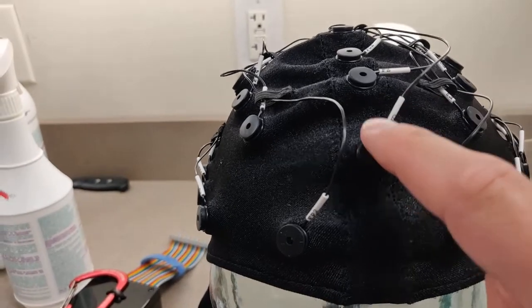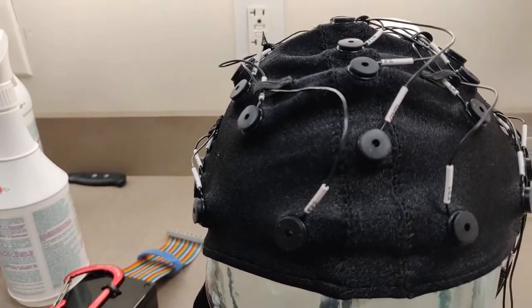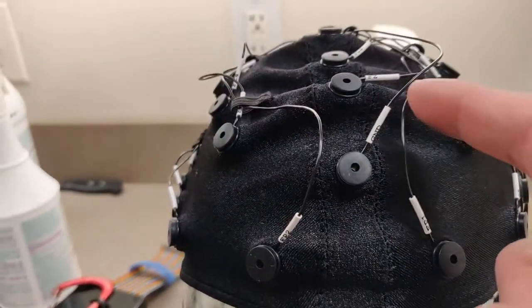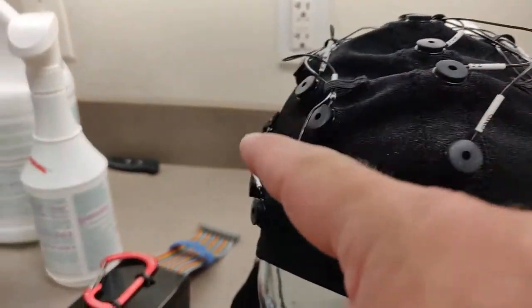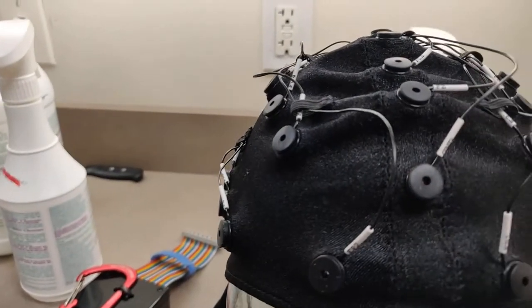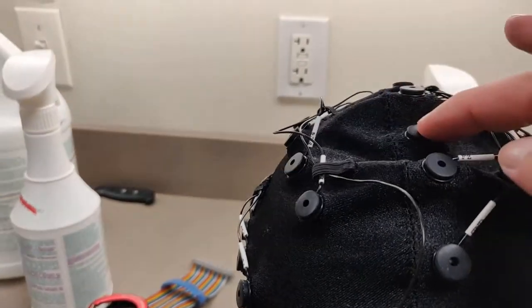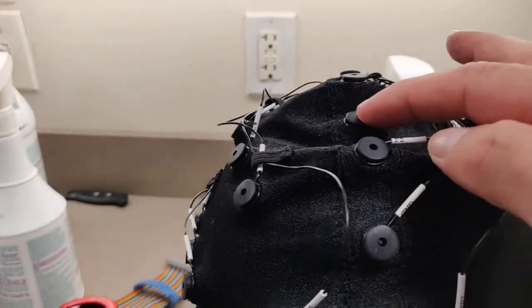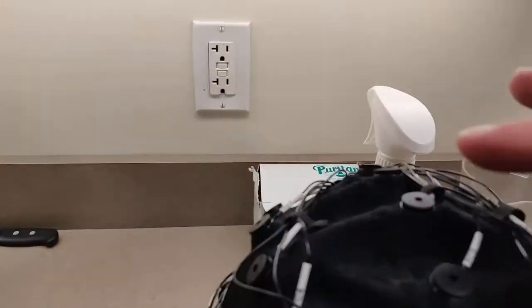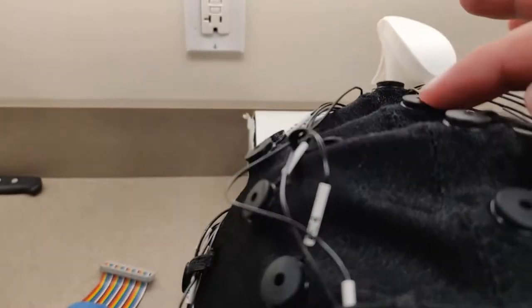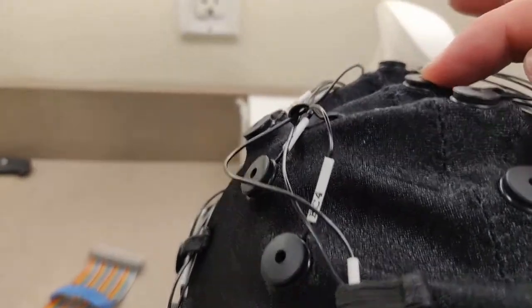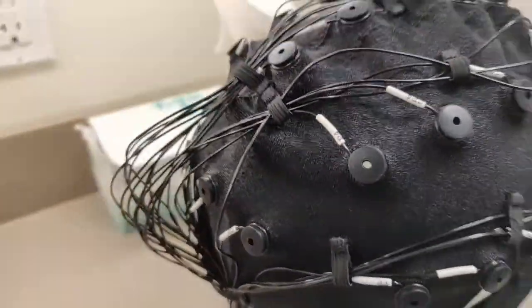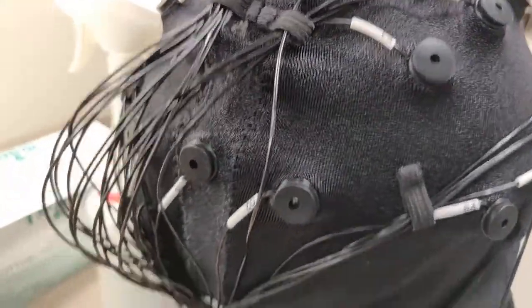So you'll fill that and work that one first. Then we have a row here in the frontal region including FZ, F3, etc. Then we have the FCZ electrode row, the CZ, the CPZ, and then a PZ electrode row in the back.